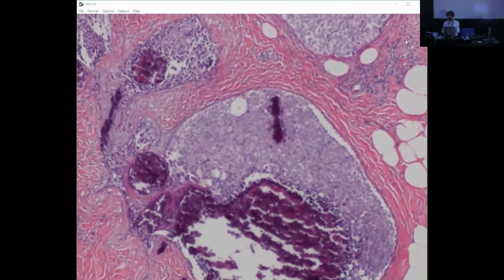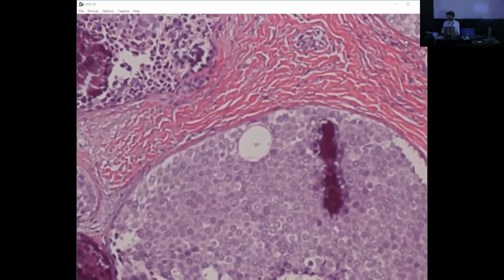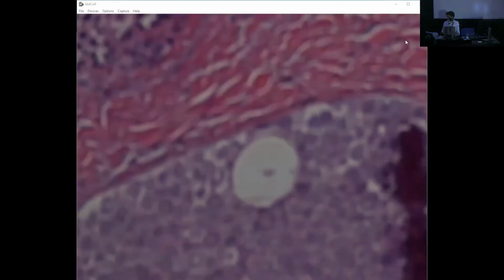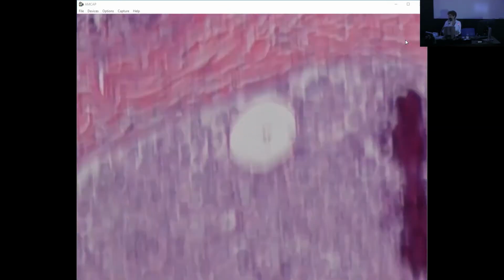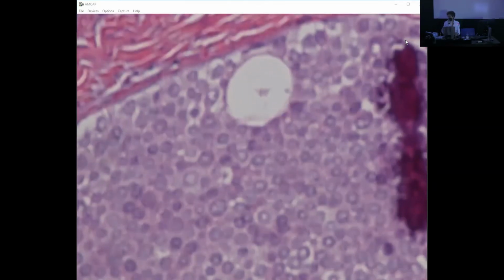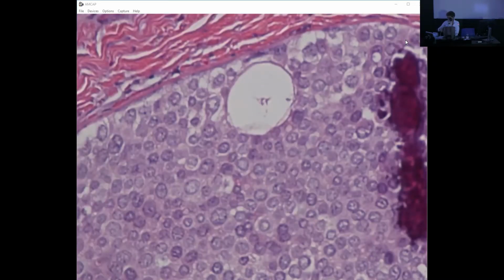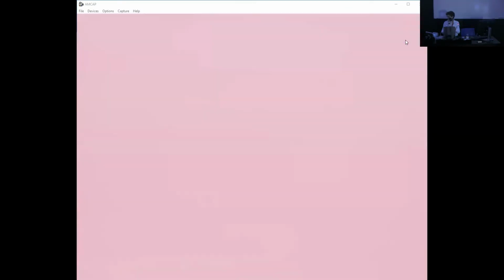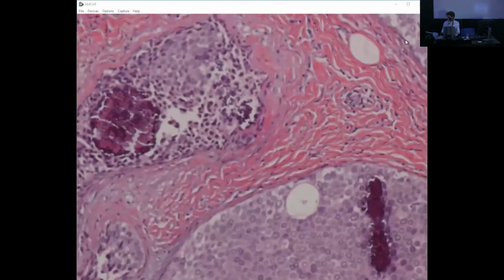I'm sending my cases here to diagnose. And actually, I don't know what's in this space, if there is a collagenous spherulosis here or not. I must say it's an uncommon finding in florid LCIS. It could be, yes. There would have to be myoepithelial cells. So this is the one case where I don't have myoepithelial stains, so we'll never find out. But the important thing is that there is no cribriform. There are no glandular spaces in this case.